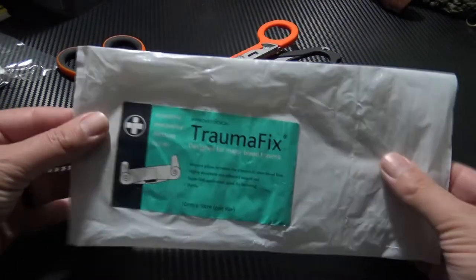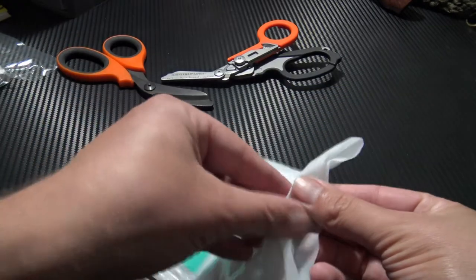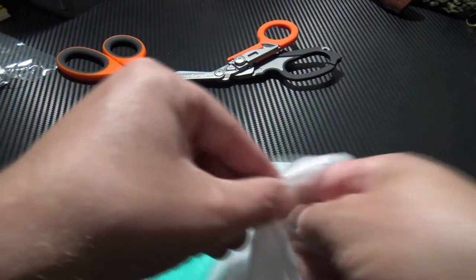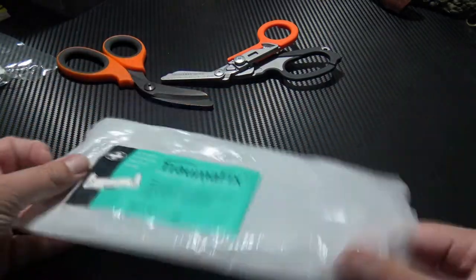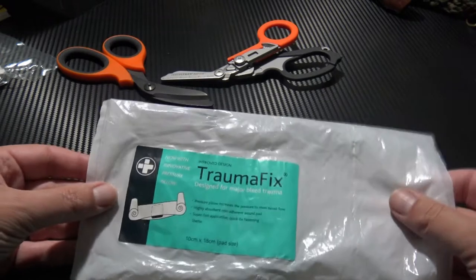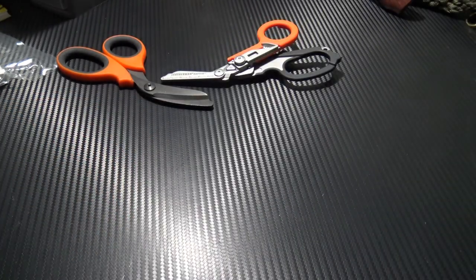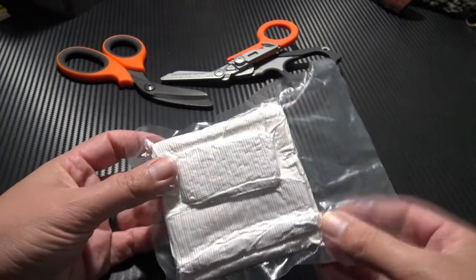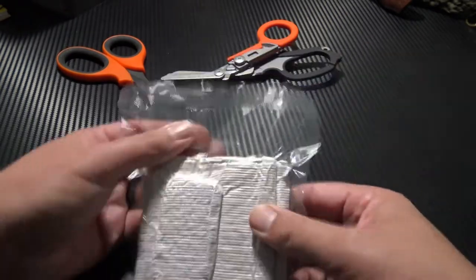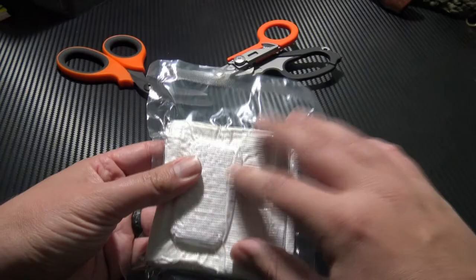It's really easy to remove from the outer packaging. You can simply tear here, pull these two apart and pull it out — or if you needed to, just rip it right open and get to it quickly. Here we have the actual dressing itself, nicely vacuum packed and sterile inside the packaging.